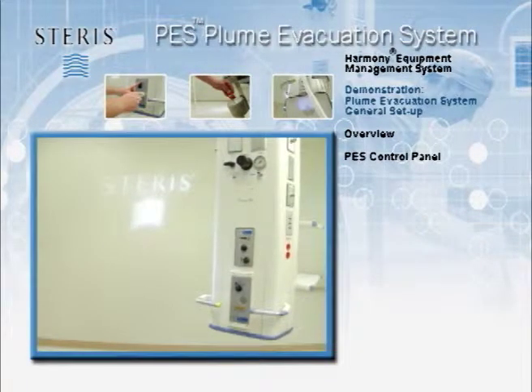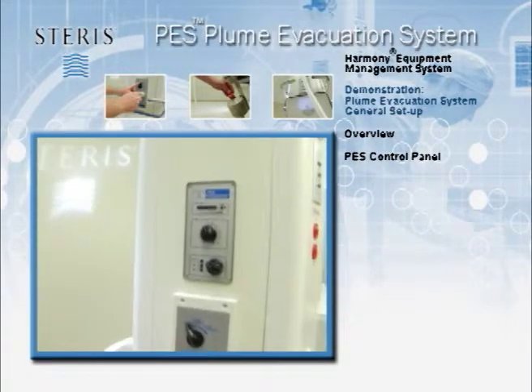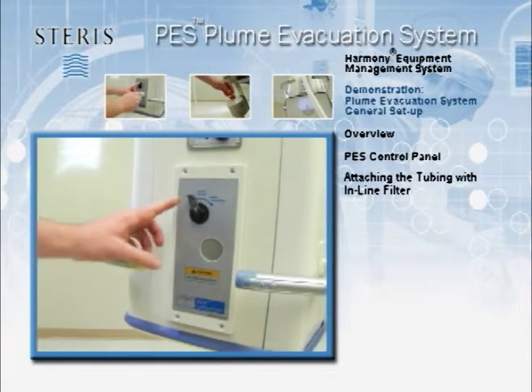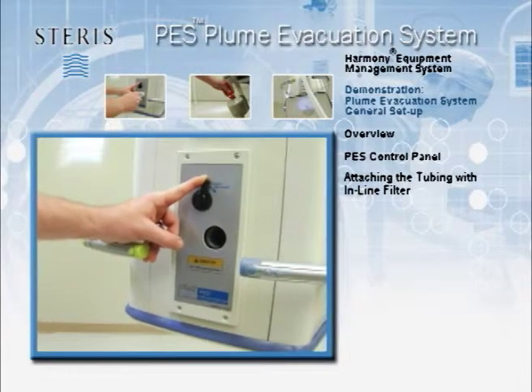The PES control panel is situated on the back of the column. The tubing connection is located on the bottom panel. Rotating the black lever to the right opens the tubing vacuum port where the non-sterile tubing and filters are inserted.